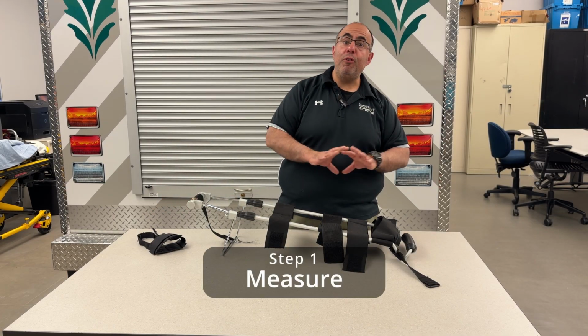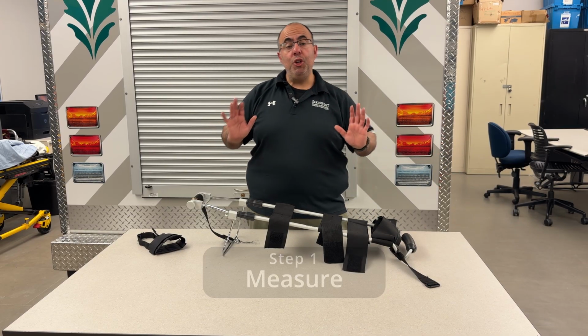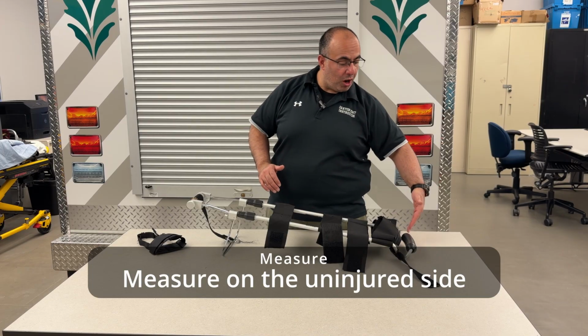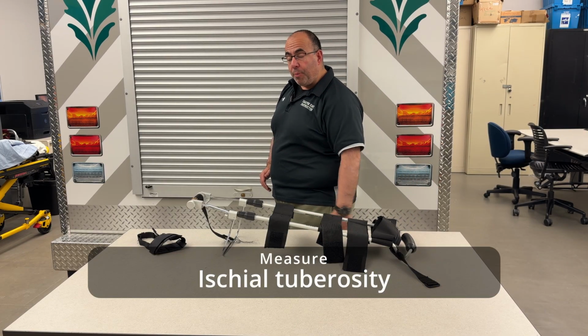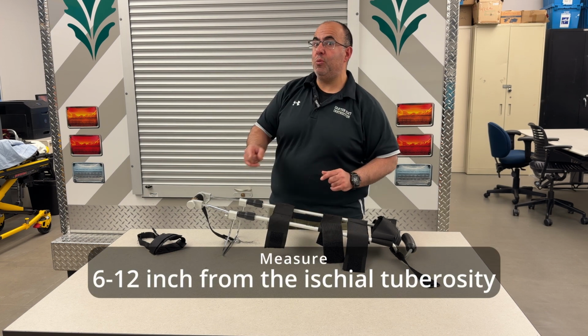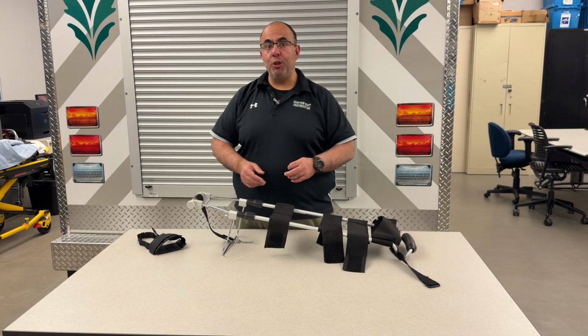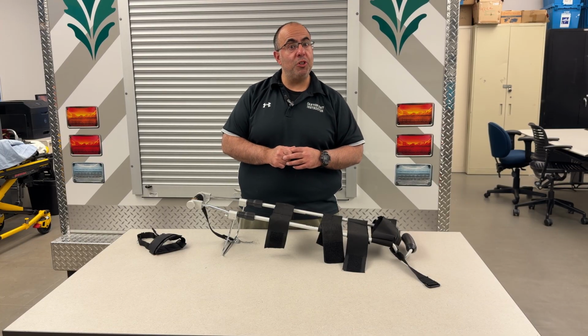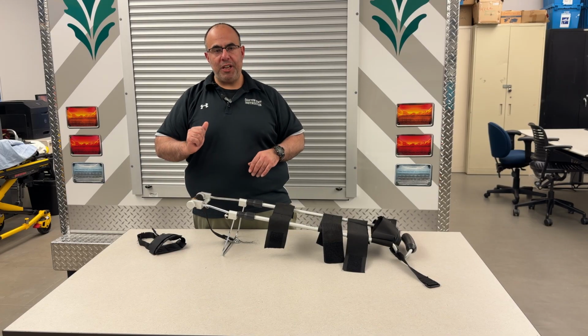The first thing that you're going to do is you're going to measure, right? You measure on the uninjured side. You start off at the ischial tuberosity, which is all the way up here, approximately 6 to 10, 6 to 12 inches on the uninjured side from that foot, depending on what your literature or the readings or what your instructors are telling you. 6 to 10, 6 to 12 inches on the uninjured side.